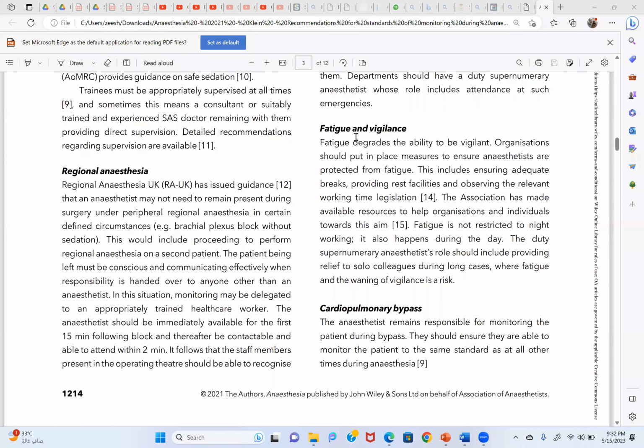You can still do one thing: attach the probe for end-tidal CO2. There are specific nasal cannulas in which it is built in, so they are telling you the breathing.